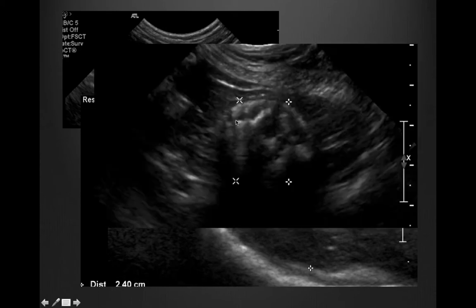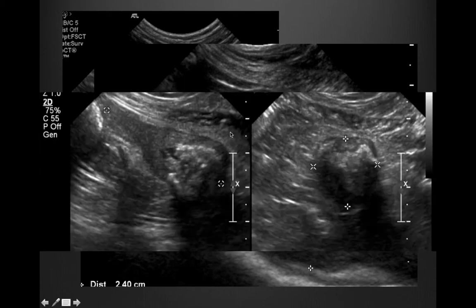You're noticing a theme: we're seeing these heterogeneous prostates with mineral within them. In our final case of another dog, we're getting the caudal aspect of the bladder leading into the prostate, shown in both long and transverse planes — again, hyperechoic regions with distal shadowing.